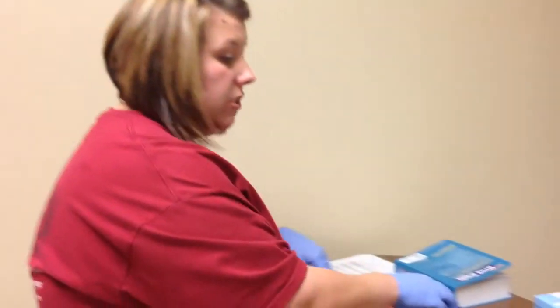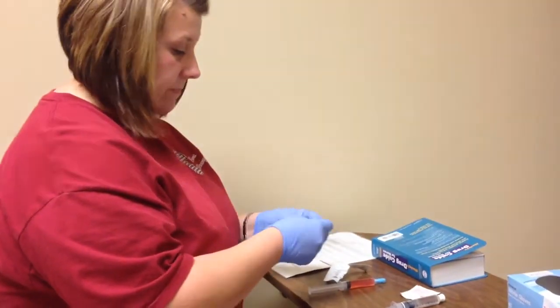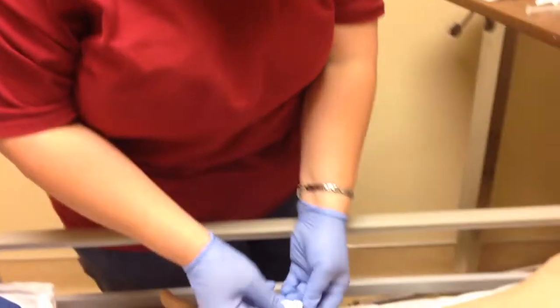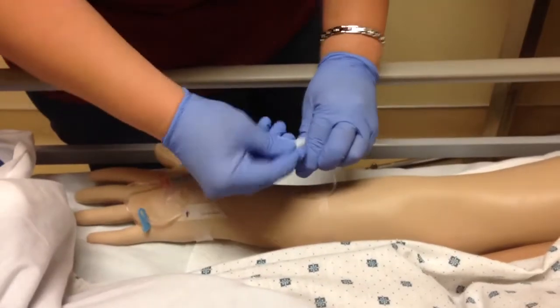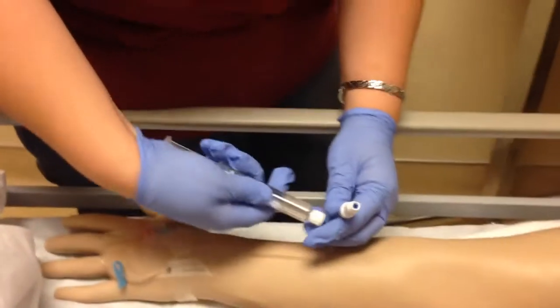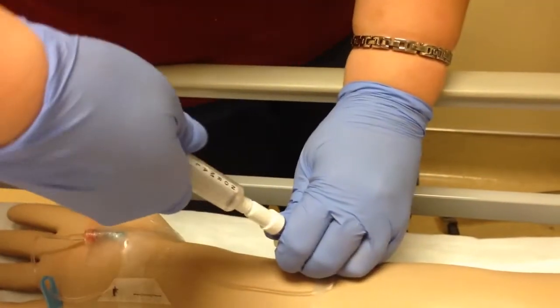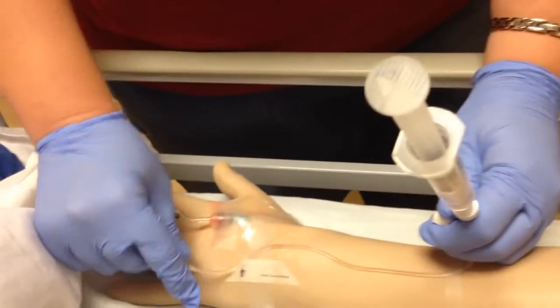Okay, so Mr. Dunn, we're getting ready to administer your medication. So the first thing I'm going to do is swab the alcohol. I'm going to get my saline syringe. I've got to unclamp.